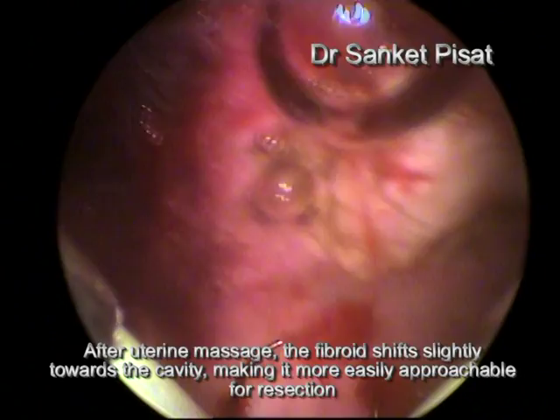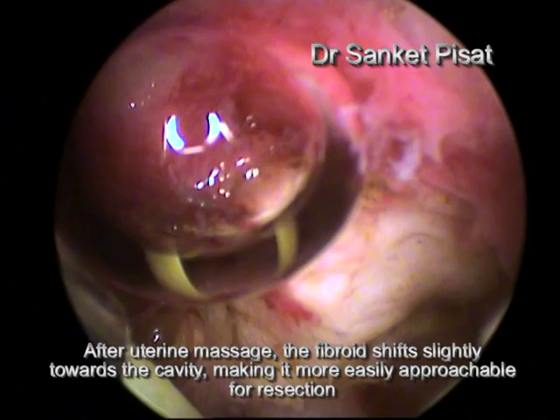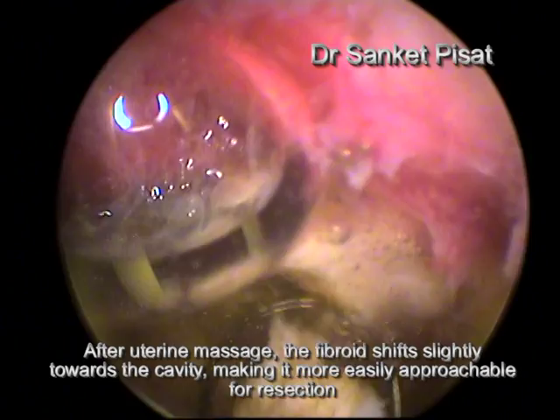After uterine massage, when the hysteroscope is reinserted, the fibroid has shifted slightly towards the cavity making it more approachable for resection. This process can be repeated.